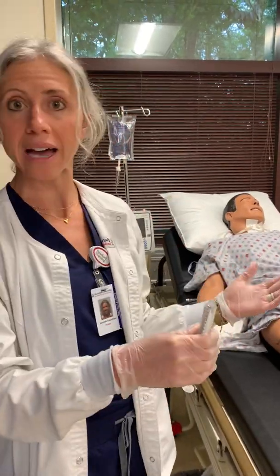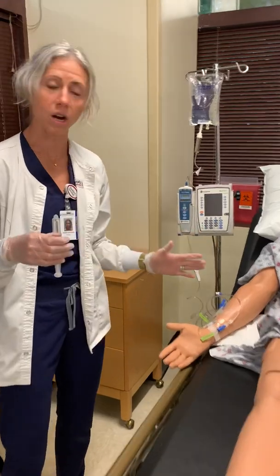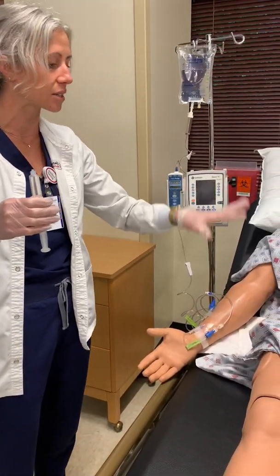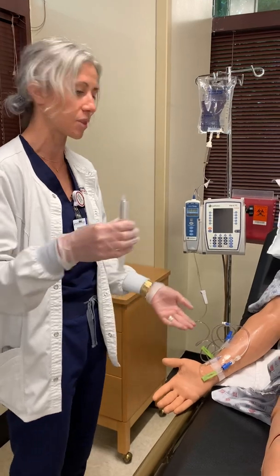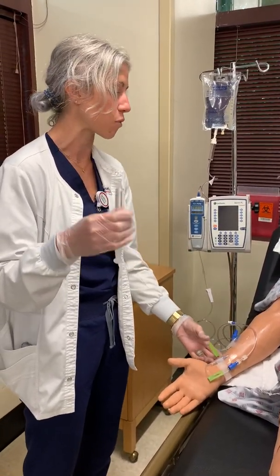And just to talk through that, to save some time, we're going to do the exact same thing. You guys remember, we washed the hub. Now in this case, let's say I wanted to use his saline lock, because he had some fluids going through here that I did not want to engage with or interact with. So I'm going to do the same thing. I've flushed it, so I've made sure my IV is good. It's nice and open. I've wiped my hub.